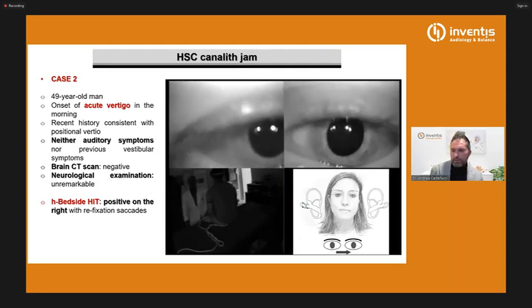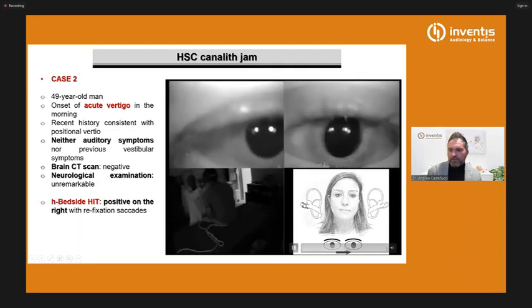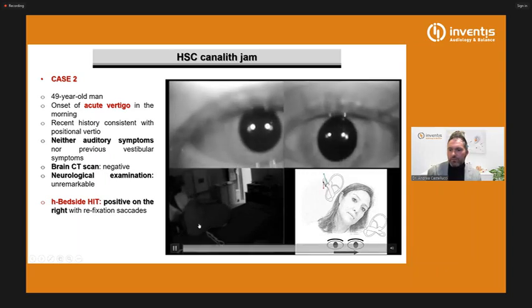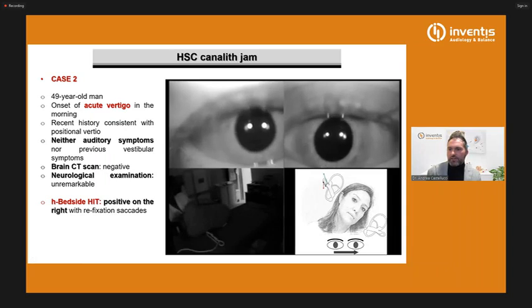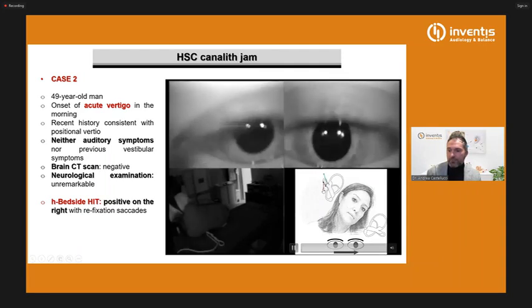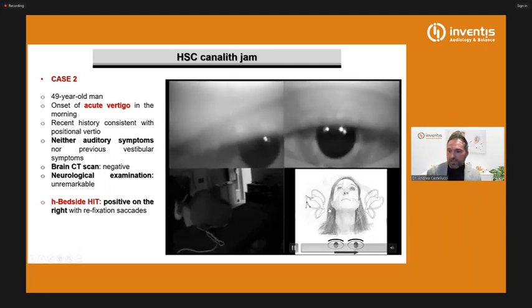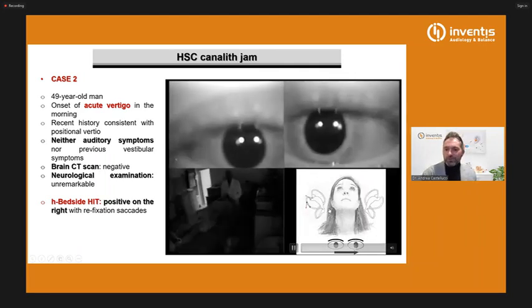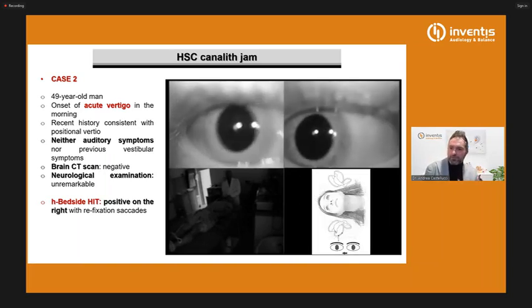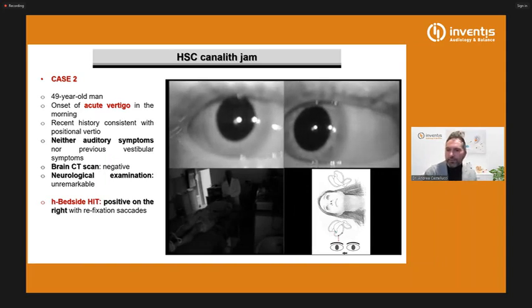So probably the clot is somewhere here that is affected by head position changes. Look, now we bring the patient on the contralateral side, and you can see how the nystagmus increases, because in this case there is the continuous negative pressure, and gravity increases this continuous negative pressure, so it adds up. The gravity vector adds to the negative pressure of the clot on the canal.